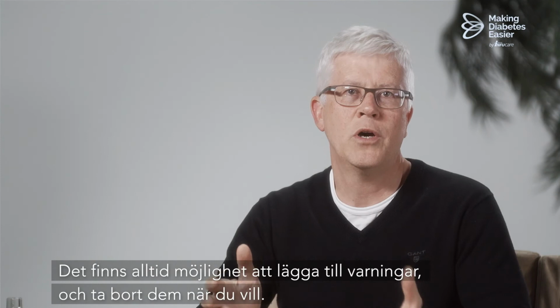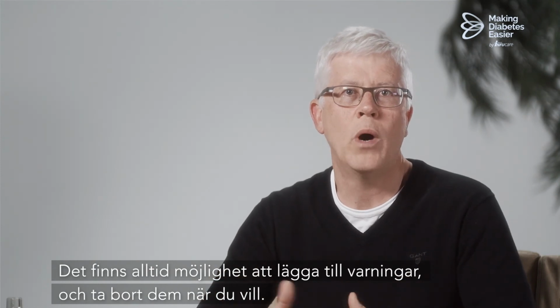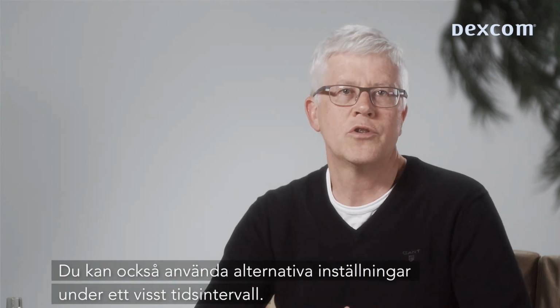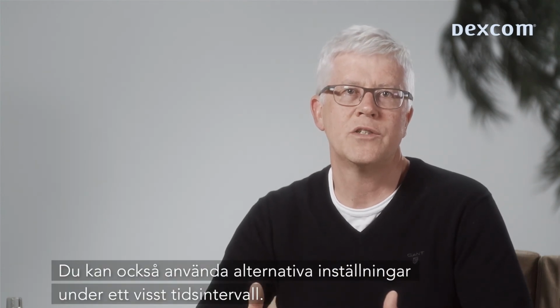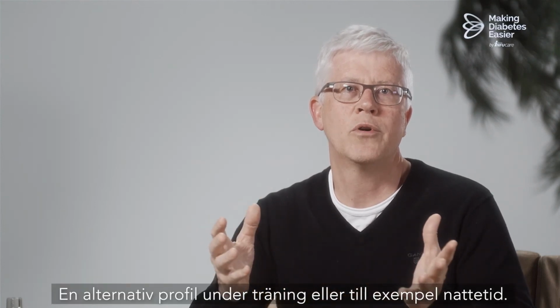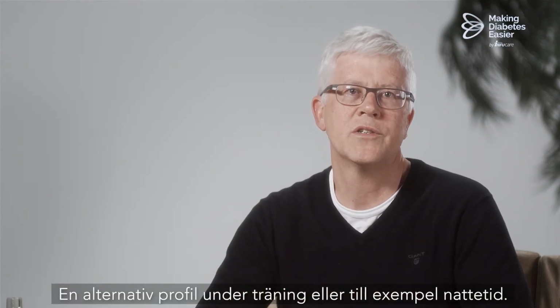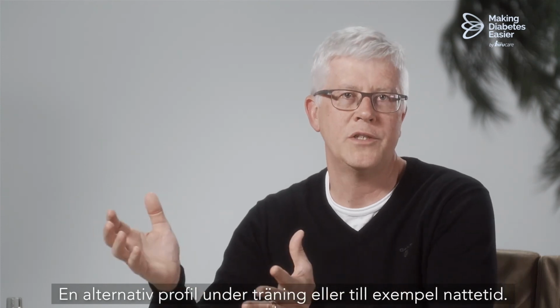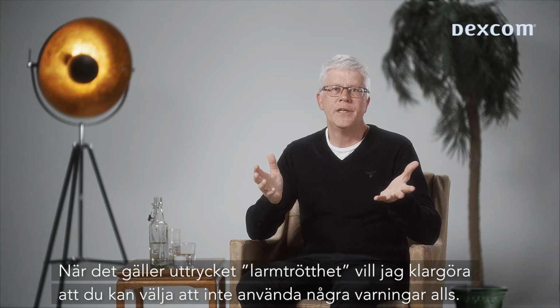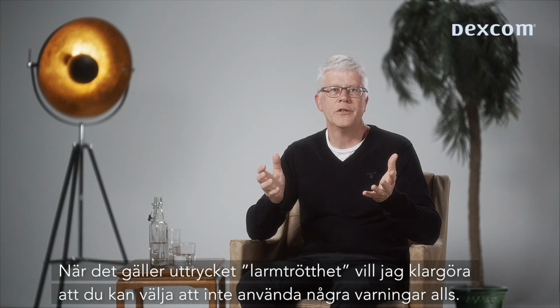There is always a possibility to add alerts for a while and remove them whenever you want. You can also choose alternative settings during a specific time interval. An alternative profile for the time of exercise or, for example, the night time. Regarding the expression alarm fatigue, I would like to clarify that you can choose not to use any alert.